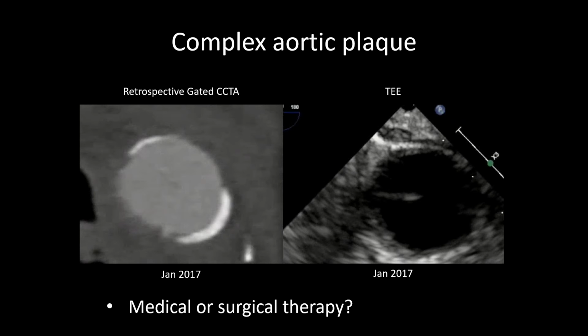just being so close to the arch vessels, I think you have to have a certain amount of distance between arch vessels or great vessels to be able to put a sleeve or a stent within something, and then obviously the risk of the procedure itself. And then is it even still there if the patient has already embolized that thrombus? Would you even need to do that if it's already been embolized and there's no persistence there? And then in that case, it would be just continued medical management of that area to prevent recurrent thrombus.